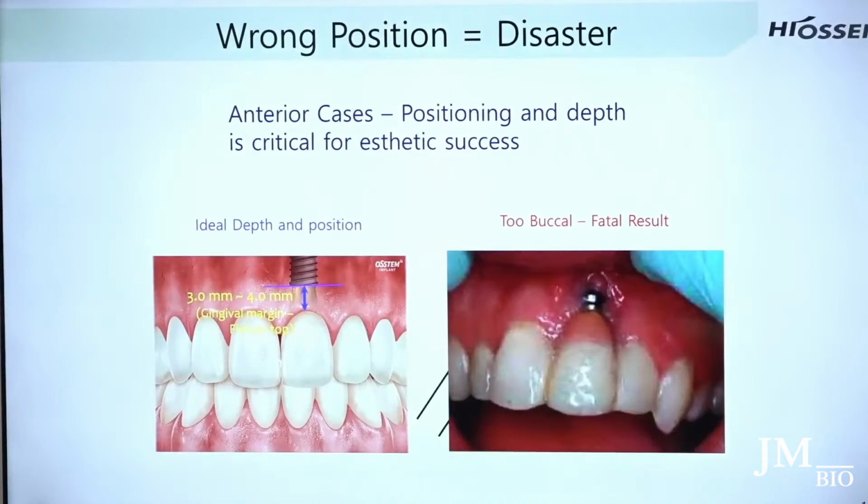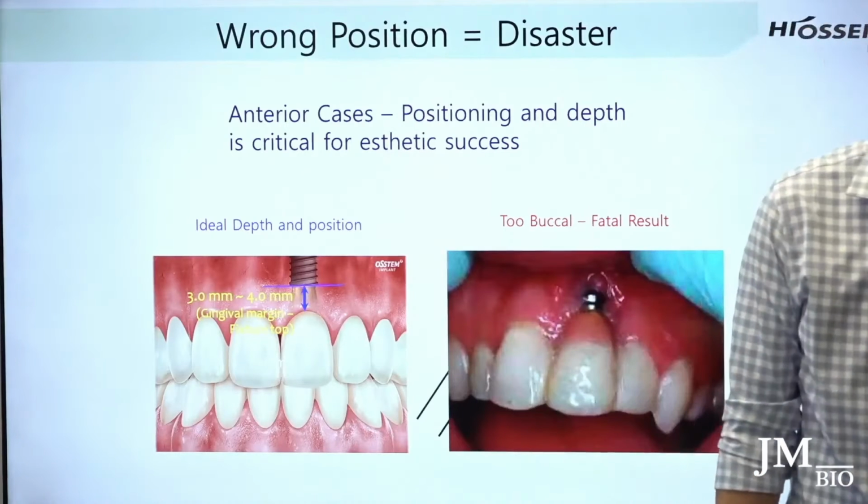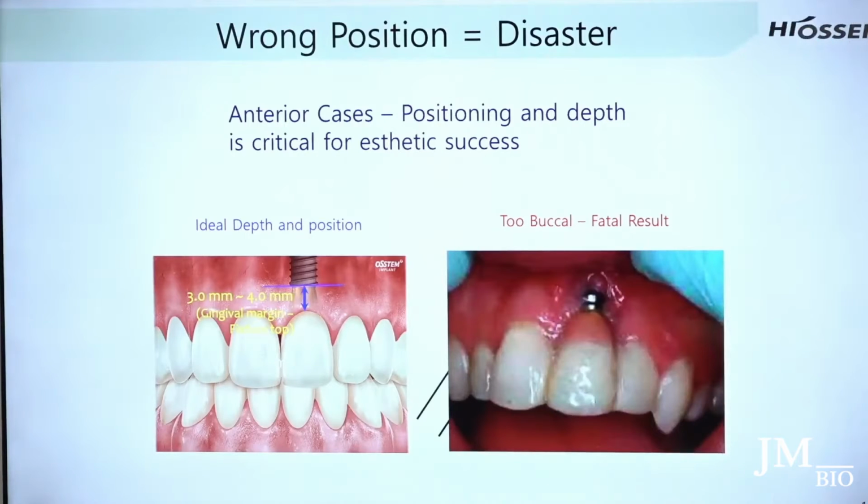And it looks ugly as hell. It looks very, very ugly. If you have a patient that has a high smile line, and they smile, you can do pink porcelain like this, but it's hard to mask. It just doesn't look right. It's a nightmare if that happens. So don't ever err towards the buccal.